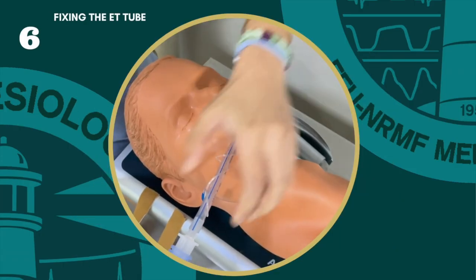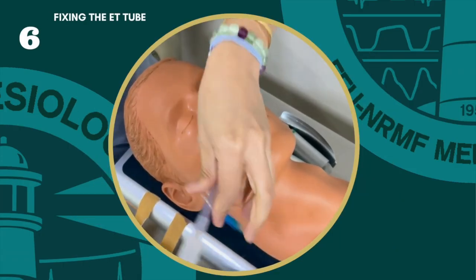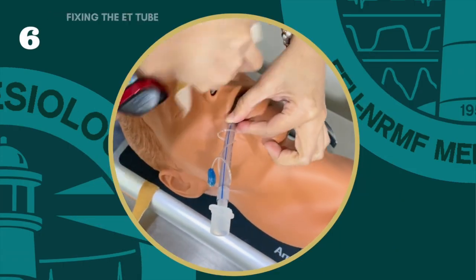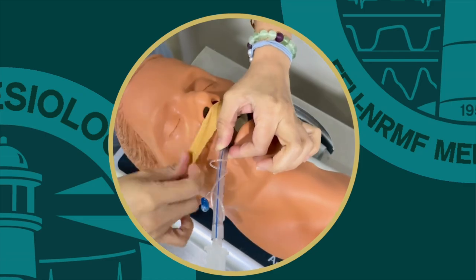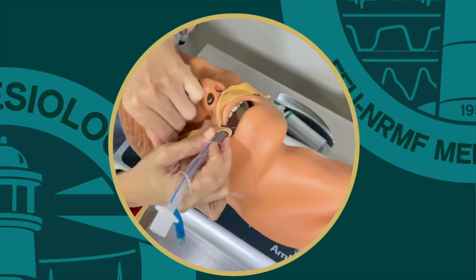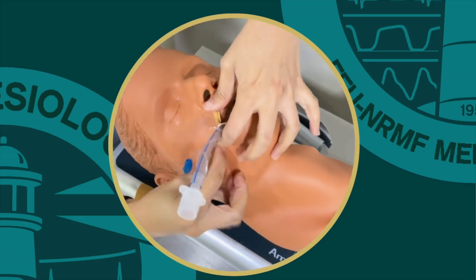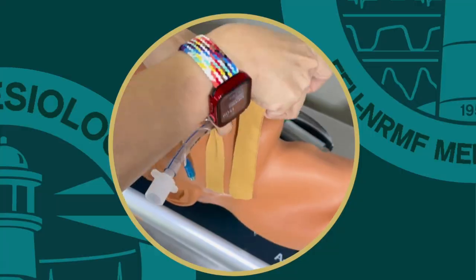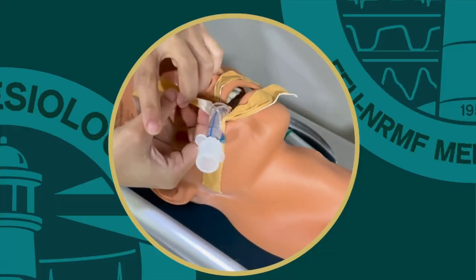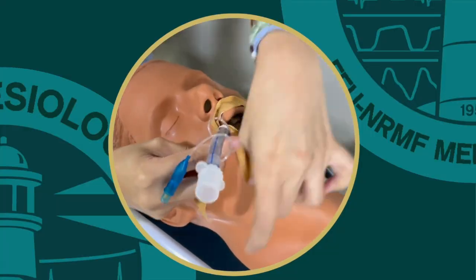Step 6: Fixing the ET tube. When the tube is in the correct position, secure it with tape and attach the ET tube to the bag valve apparatus and continue to ventilate the patient.